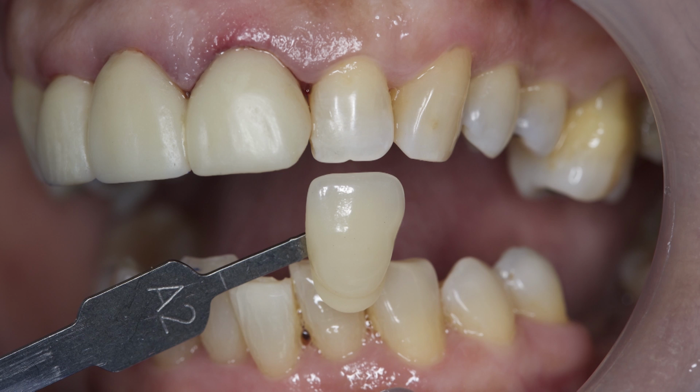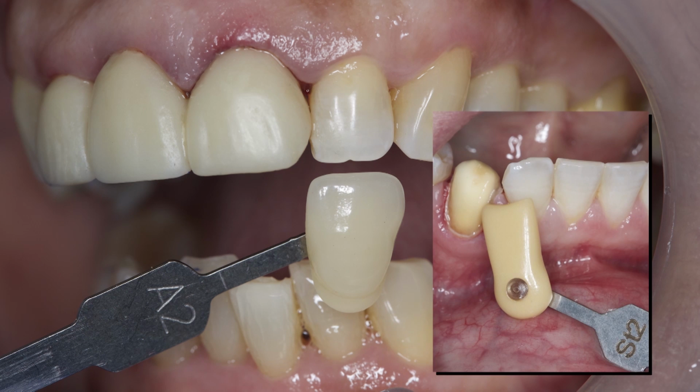When we want to change the shade of the final restoration, if the prep is, for example, slightly darker, then it is important to have a picture with the stump shade as well. If the prep is too dark, or if there is a metal post, then BruxZir Anterior will not be indicated, as the translucency of this material will pick up on the dark underlying structure.